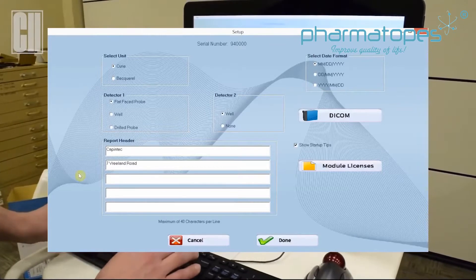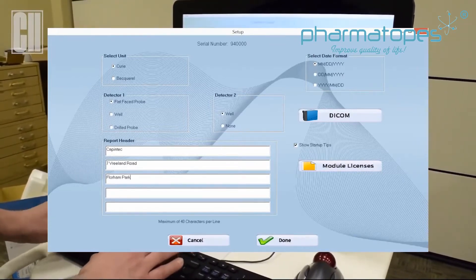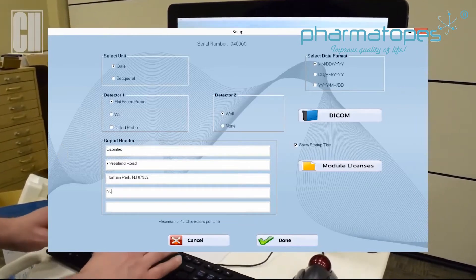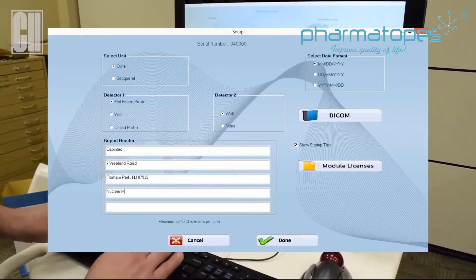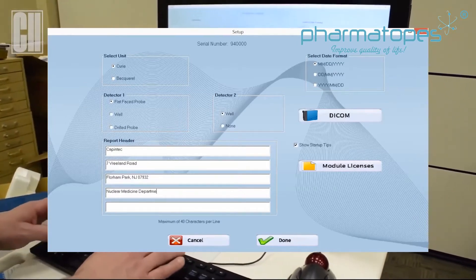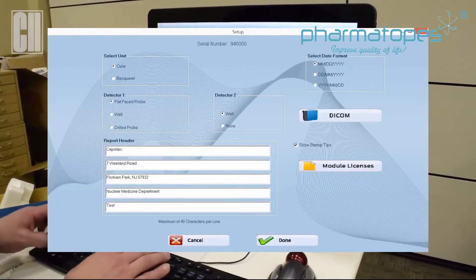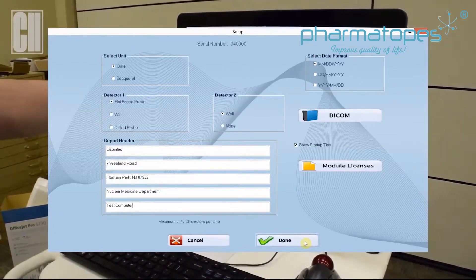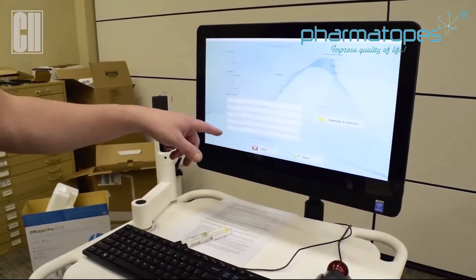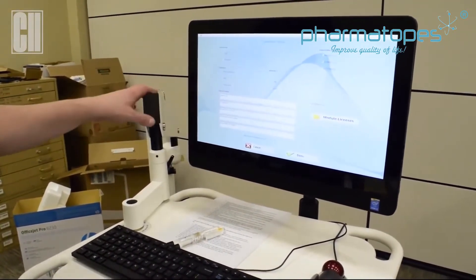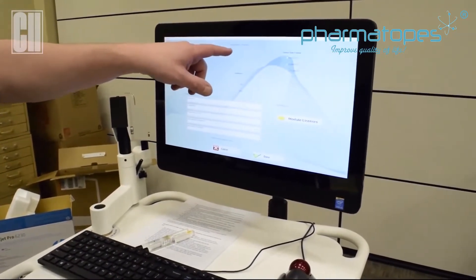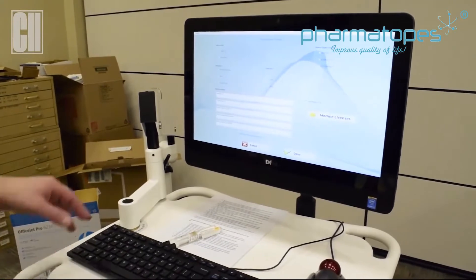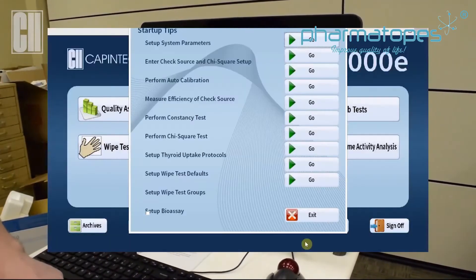We're going to put in our address. The report header typically in the field when installed: the address would be located at the top three lines, nuclear medicine department on the fourth line, and then the serial number of the system on the bottom line. The serial number for the system would also be located at the top, and that should match the serial number that is on the isolation transformer at the bottom of the stand. Once we have that information in here, press Done — that is our system parameters.